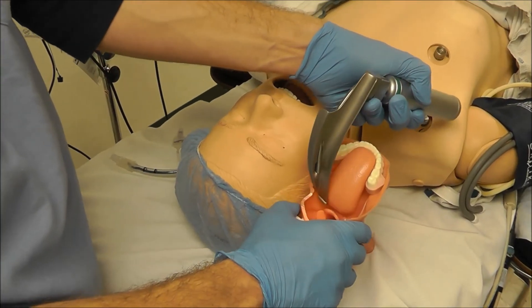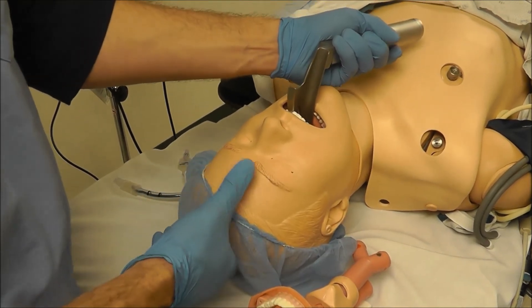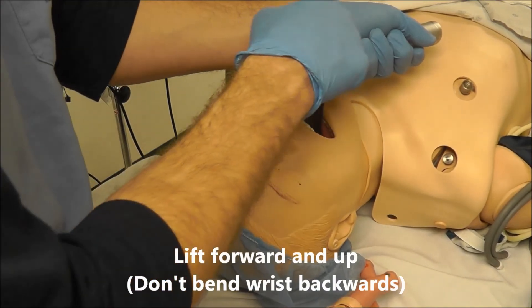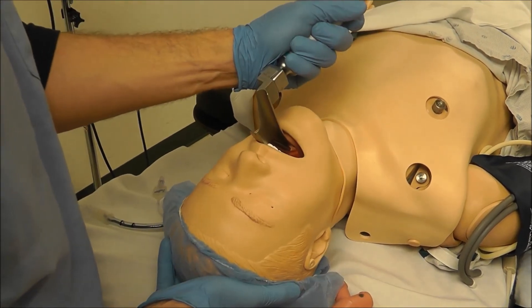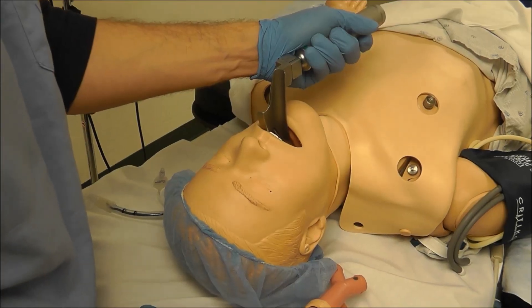Once you're in the vallecula and it's time to lift, watch my wrist here — make sure that you actually lift without bending your wrist. You don't want to bend your wrist back as soon as you get into the vallecula, because you can risk breaking the teeth.